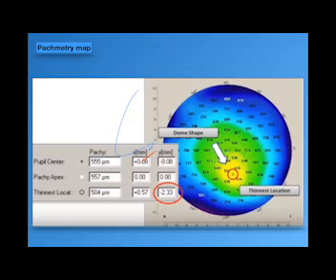If you find a scar in this cornea, and in a lot of patients we may find scars in the cornea, post-traumatic, post-trachomatous, post-foreign body, there is a nebula in this cornea. This will explain the abnormality, and it can go for refractive surgery. Yes, sir. If you have no suspicion of keratoconus, you can go for refractive surgery if the other factors are provided. Okay. The first question I will discuss with you after some slides.